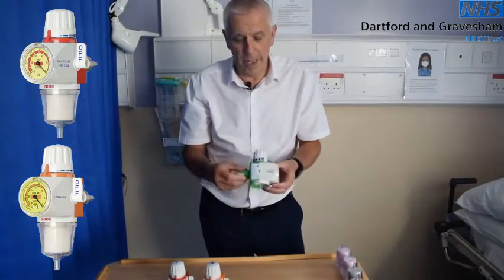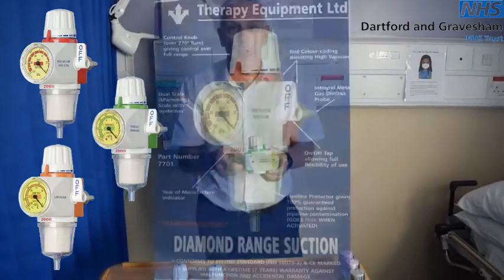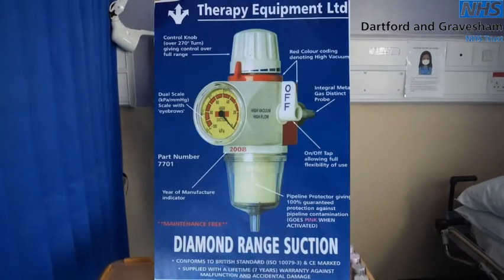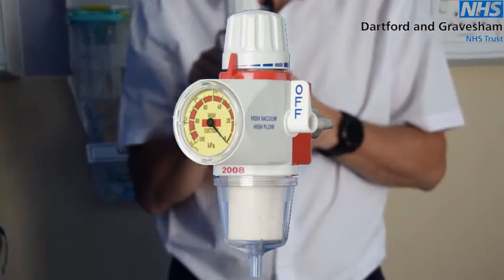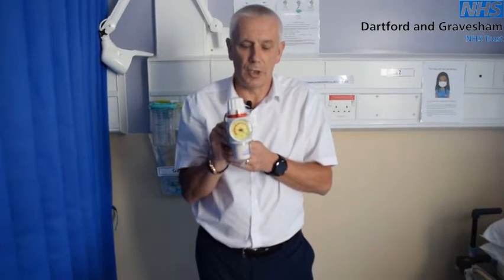Thirdly, we have the thoracic suction unit. This is used purely for chest drains only and is the only unit that can be in use while unattended by a nurse. On the bottom of a unit is a pipeline protector. The pipeline protector protects not only the unit itself but also the ring that provides suction throughout your hospital. Should that get contaminated, you'd be looking at a 24-hour shutdown while it's cleaned.